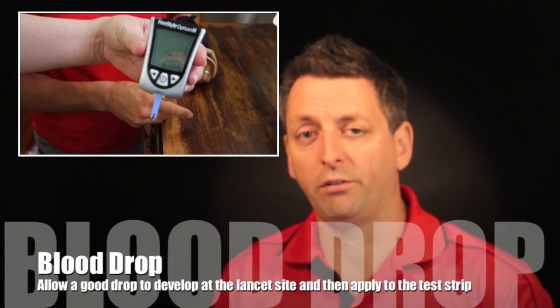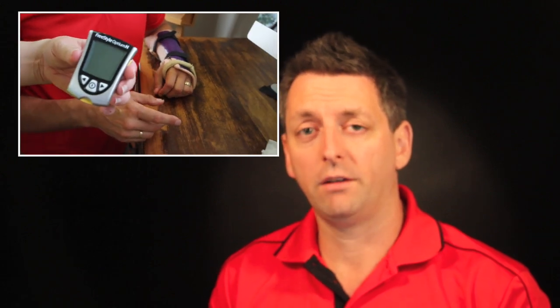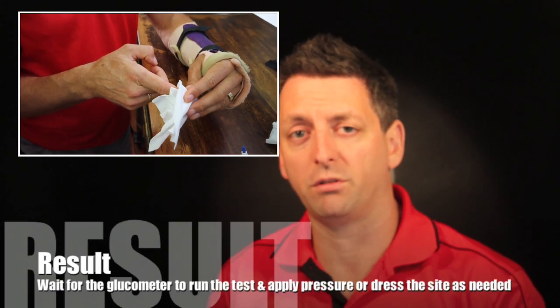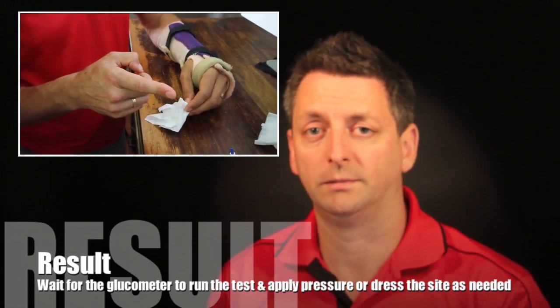After you've got enough of a sample — depending on what machine you use, the required volume will vary — give a little dressing over the puncture site to the patient, or some patients just put a bit of pressure on there for a minute. Then record your blood sugar level.